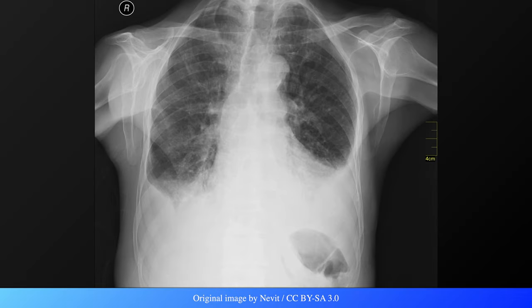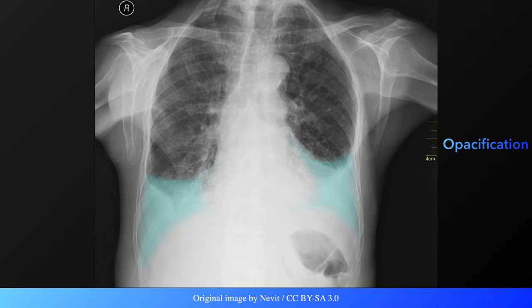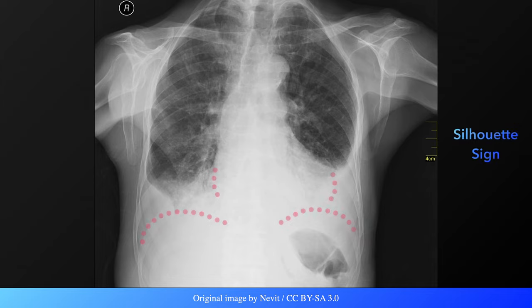This is a plain radiograph of an individual with bilateral pleural effusions. The first abnormality that is readily apparent is the dense homogeneous opacity present in the costophrenic angles. Unlike with consolidation, air bronchograms are not present.